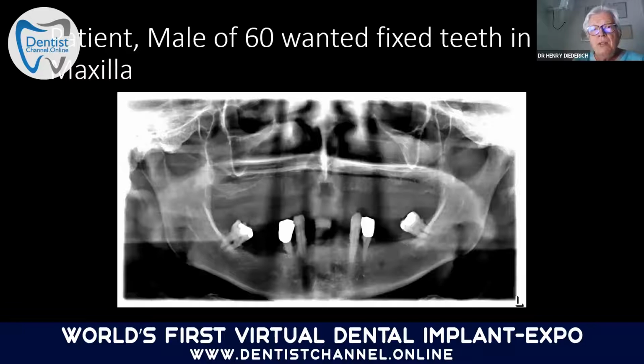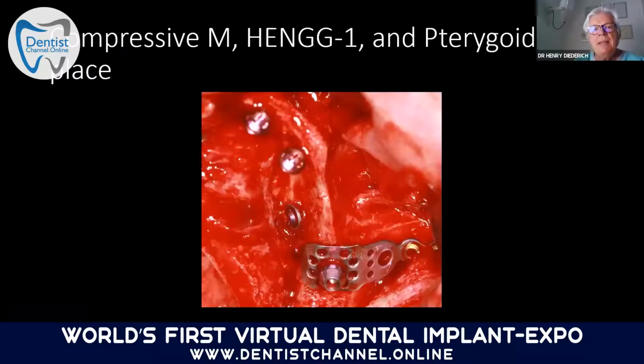Well, this patient, 60 years old, he wanted fixed teeth in the maxilla. Also, bone conditions were very bad. And here we fixed different types of implants. Here we could use 2-piece implants.